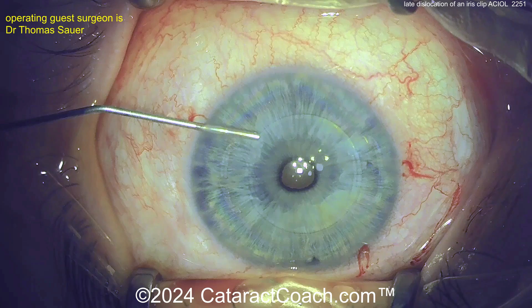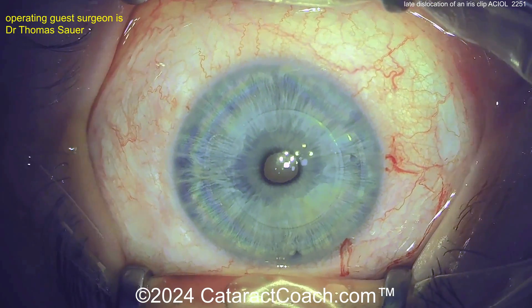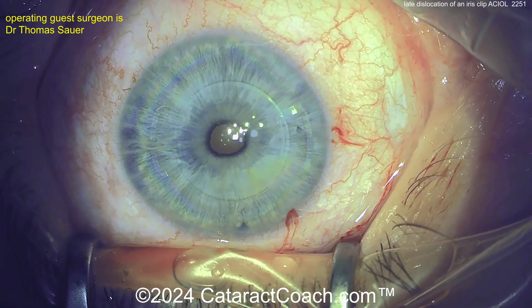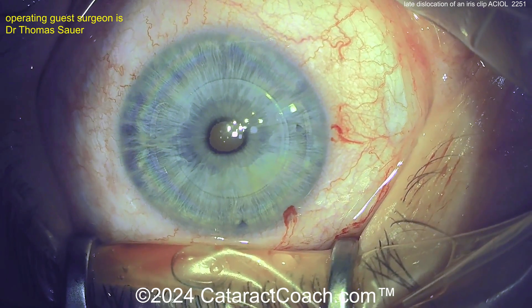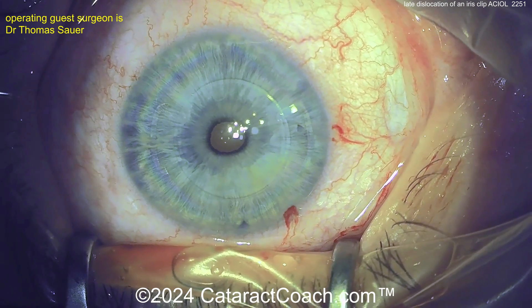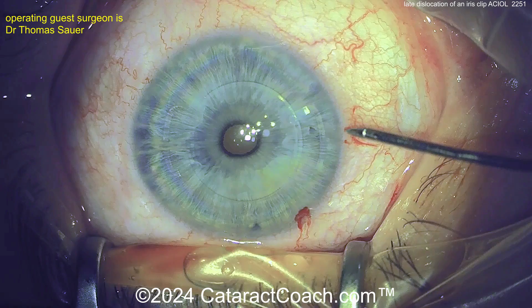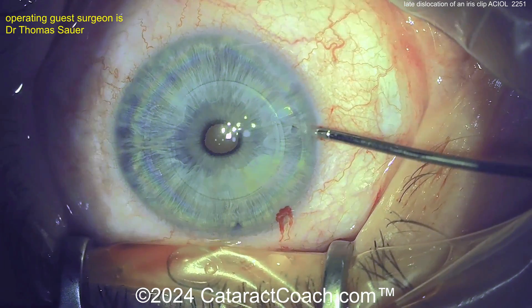It looks like it has those claw-type haptics, where you need to open up the claw, grab a good amount of iris tissue to put inside of it, and then release the claw. There are instruments designed for this, such as the Budo forceps to hold the optic — those were designed for the Worst lens — and also the enclavation instrument.